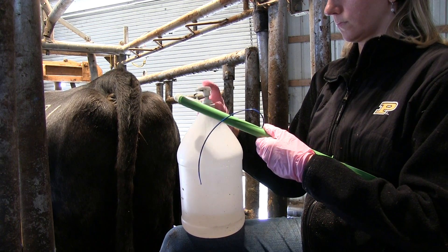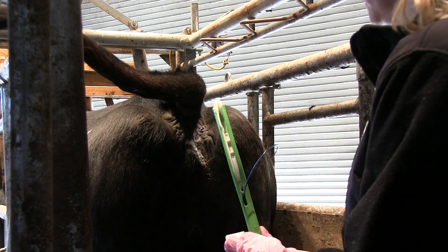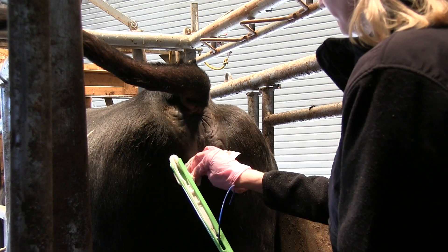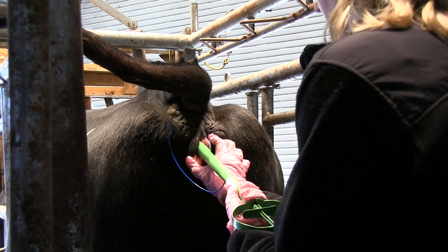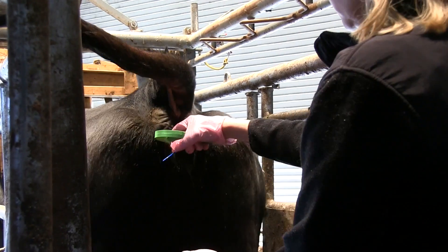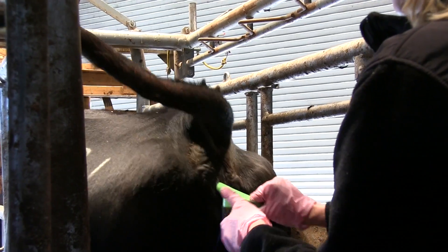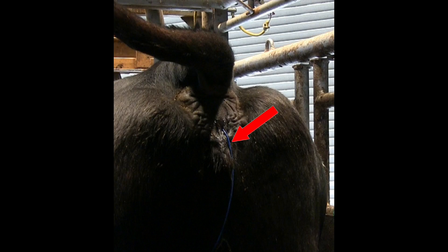Once the CIDR is loaded in the gun, coat it with ample amounts of lubricant. Approach the cow with caution and use paper towels to clean behind her and remove any manure from the vulva. Use one hand to spread the lips of the vulva and the other hand to insert the insertion gun. Once you feel resistance, push the handle on the gun without backing out until full depression is made on the handle. It is best for the tail of the CIDR to come out from the vulva and point down towards the cow's feet, to minimize the chance of it being inadvertently removed by other cows or her tail when she wags.